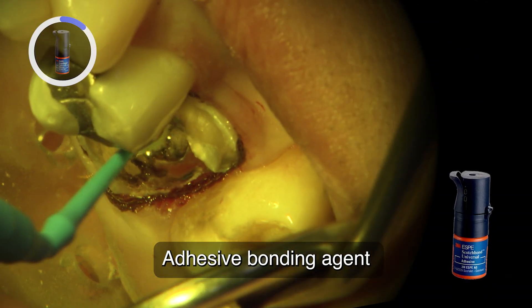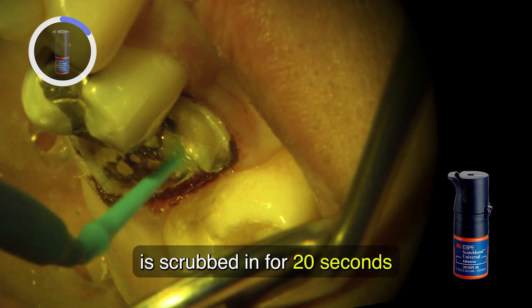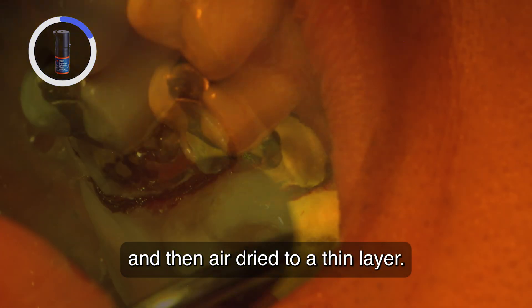Adhesive bonding agent by 3M Scotch Bond Universal is scrubbed in for 20 seconds and then air dried to a thin layer.